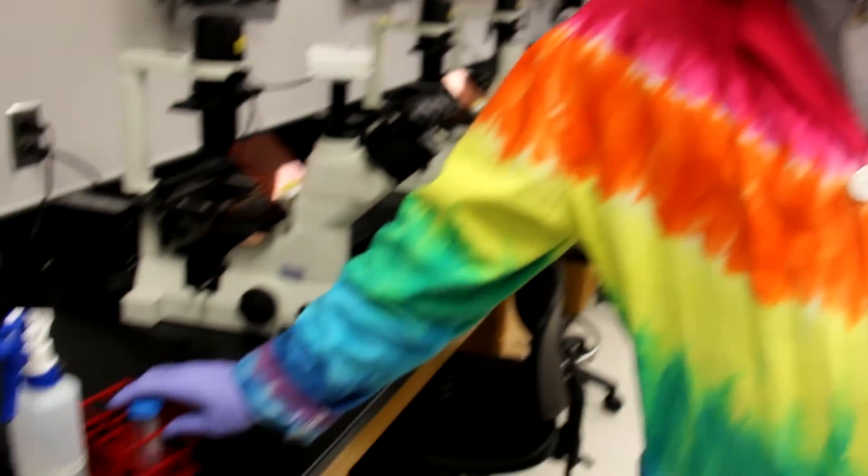Today we're going to be working through the process of splitting cells. For a first step we need to prepare the materials we're going to use in that process, and that includes the media that we're going to add on to the cells, as well as the cells themselves. Now the media I've got ready to go right here. We're going to now go and collect our cells.